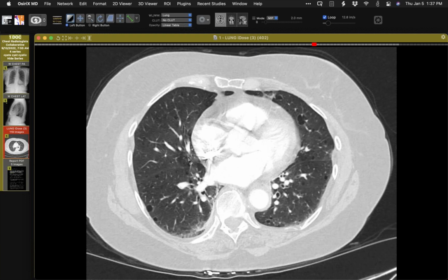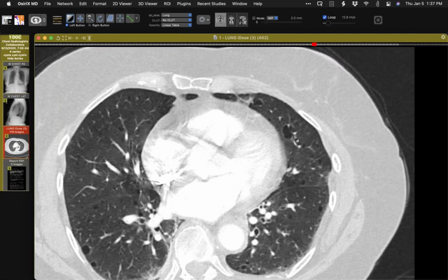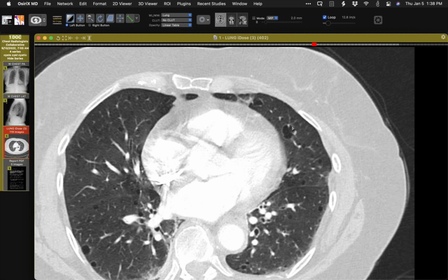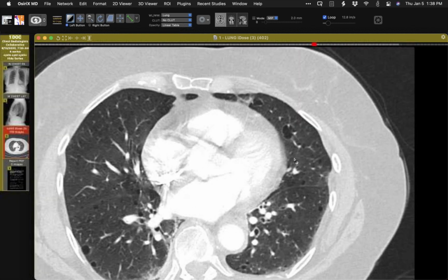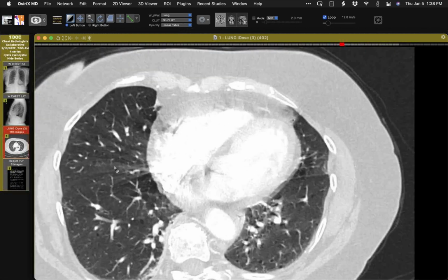And there was one here where, for example, it's possible that there is a vessel that at least traverses, perhaps in part, the periphery of the cystic space. So the cystic space is developed in close proximity to vessels, but otherwise hasn't really disturbed them. There's a little bit of tissue there and a vessel passing through its periphery, but most, of course, are very small.